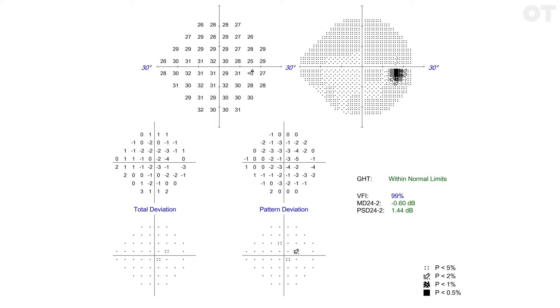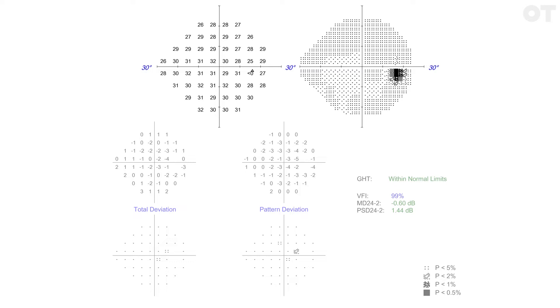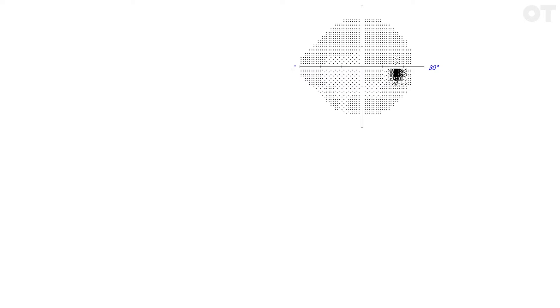Let's move on to the numerical and graphical data. The top two plots represent the raw data. The top left plot shows the numerical threshold sensitivity values in decibels at each stimulus location. So that's how bright did the machine have to make each point for it to be seen. This data is presented in grayscale in the top right plot as a more visual representation of this raw data. Do not rely just on the grayscale plots for interpretation.